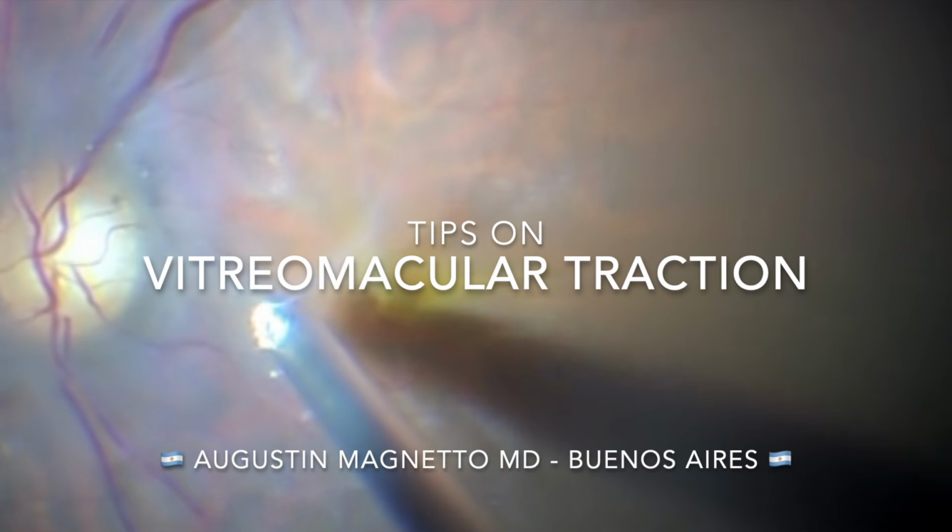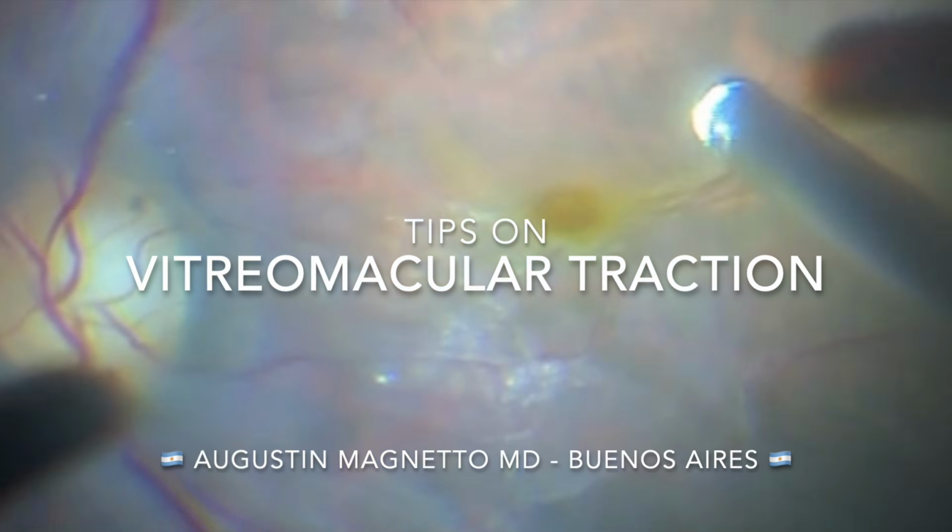In this video we discuss tips for surgery in severe vitreomacular traction with foveoschisis.